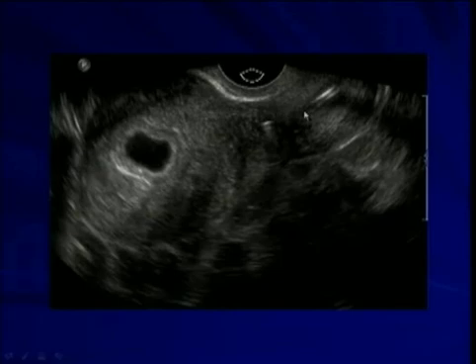Here, another example of an IUD. The long stem is in the cervical canal, and the short stem is perpendicular to it, coming out at us, embedded in the lower uterine segment in the presence of an intrauterine pregnancy which progressed normally.